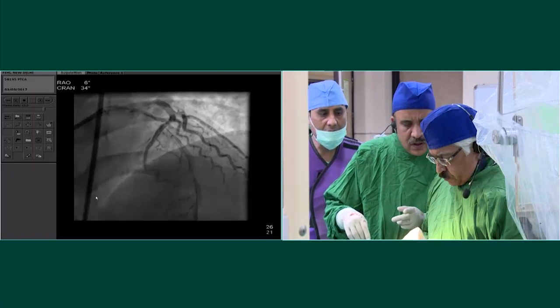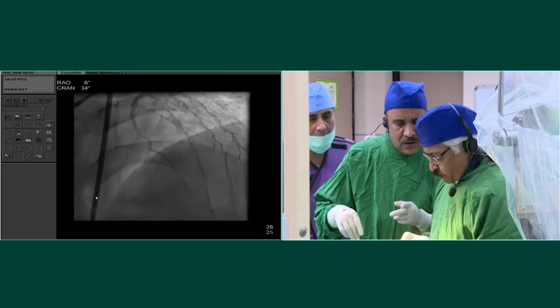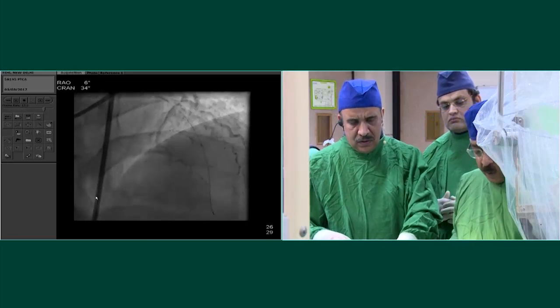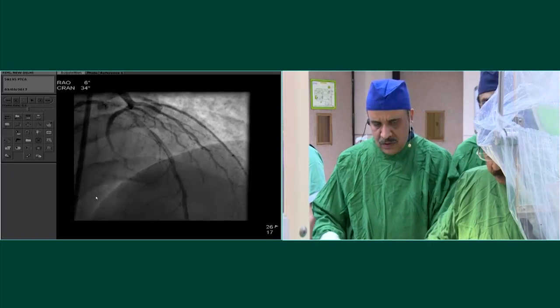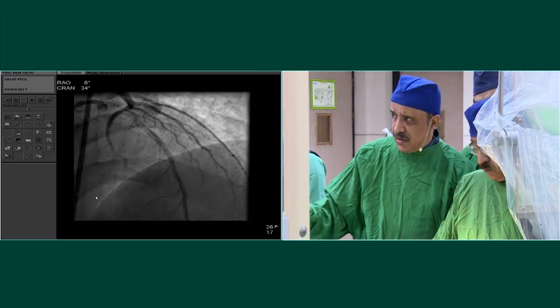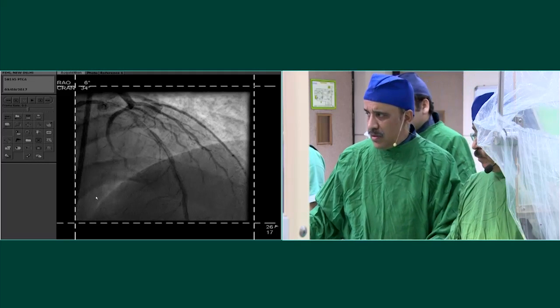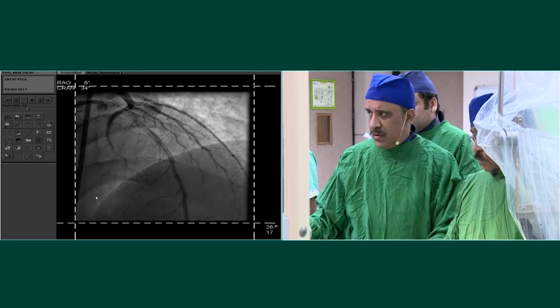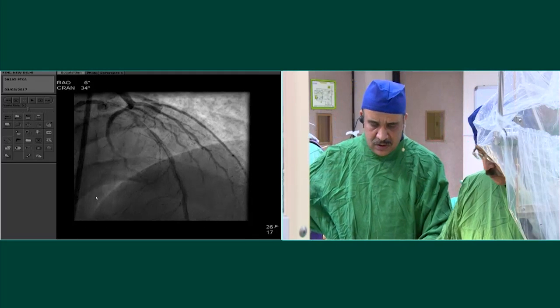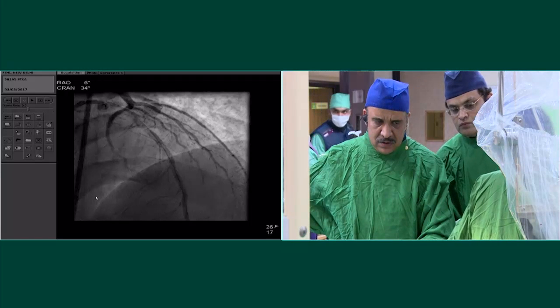Yeah, I fully agree with you. I think it's safer, and I'm not sure that there is any difference in the result. Correct, that's the whole issue. I know the balloon for the predilatation should be less aggressive, in order to avoid the risk of an extensive dissection. So it's better to do a suboptimal predilatation for the preparation, and after the BVS implantation, followed by an aggressive post-dilatation.